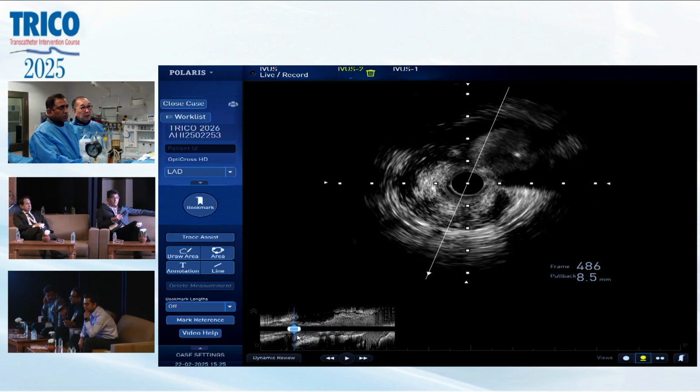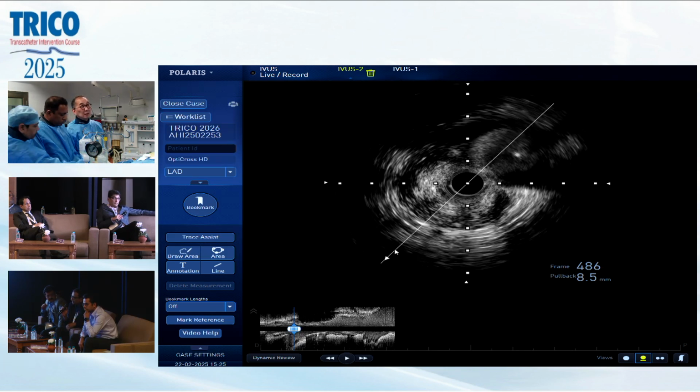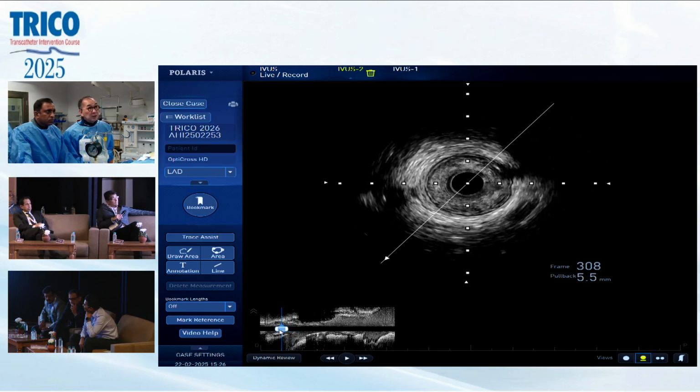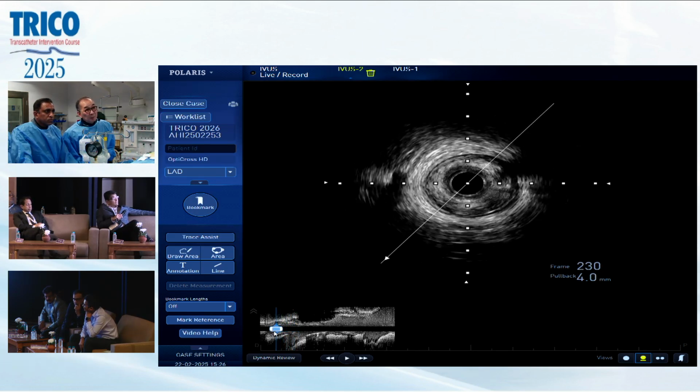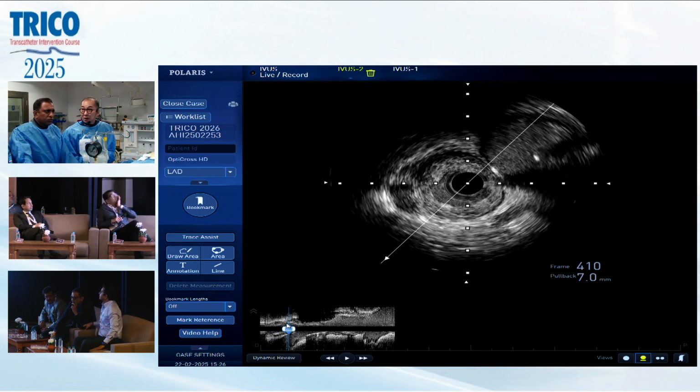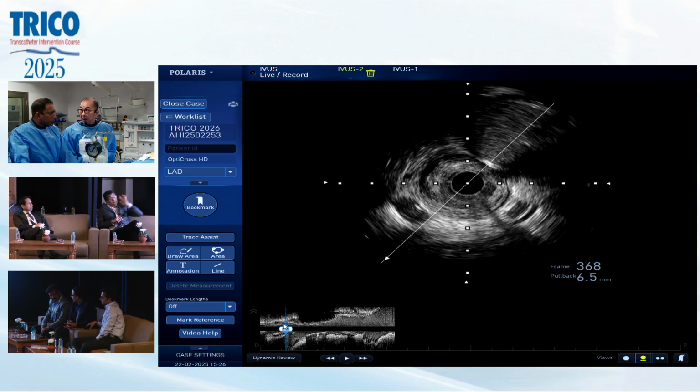Sometimes it's better to take an intermediate size when the size discrepancy is great between the distal and the proximal vessel. You take an intermediate size and don't blow it up to nominal. Go subnominal and blow up to a bigger size. The proximal is about 4.0 by IVUS, 4.2 by IVUS, and distal to bifurcation is 2.5. But I think we can get a 3.0 or 2.75 by angio. How long is the stent? About 20, 24, 28?